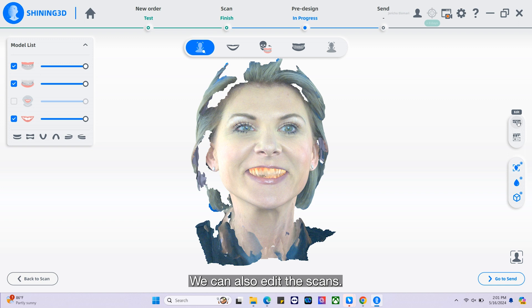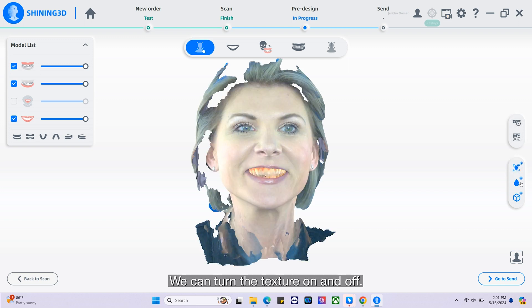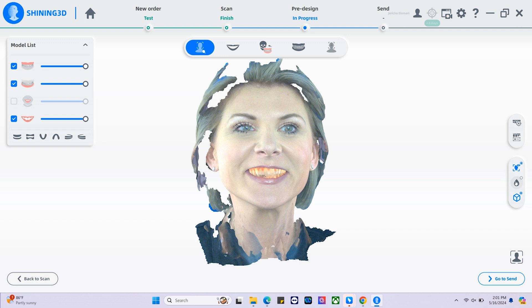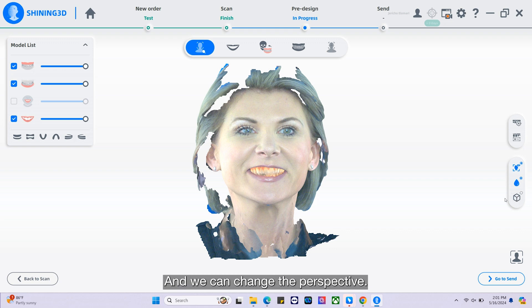We can also edit the scans. We can turn the texture on and off, we can smooth, and we can change the perspective.